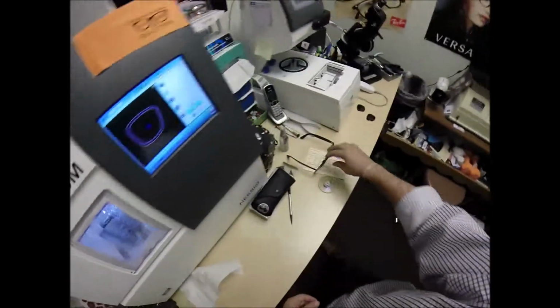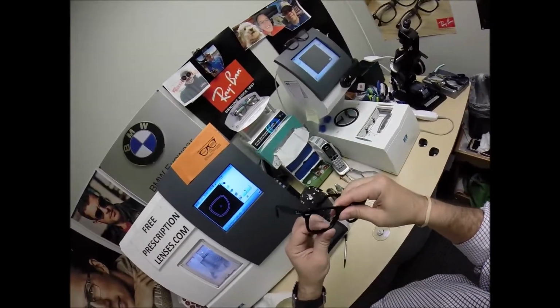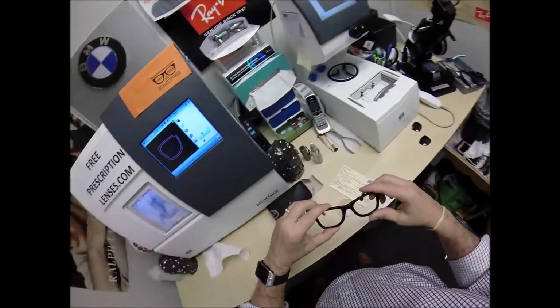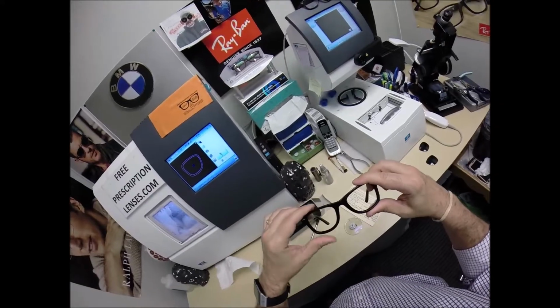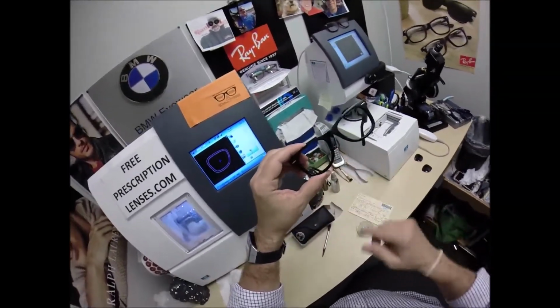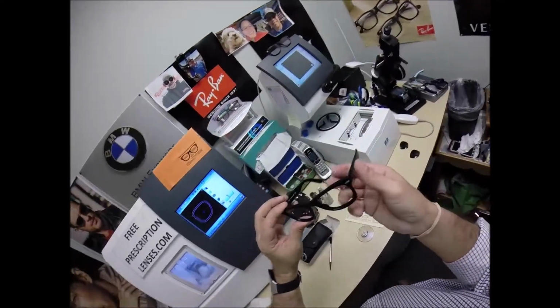Having said that, because this frame is so thick with a thick bevel, I will actually anticipate, I reserve the right to use heat. On little skinny frames, I don't want to force the lens in there because it'll cause the frame to stretch or roll. There's no way you can stretch this frame. This frame is built like a tank.